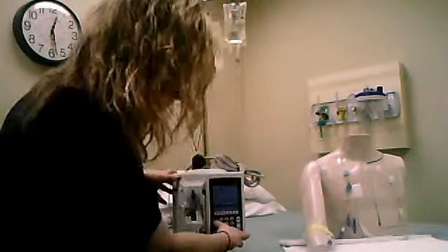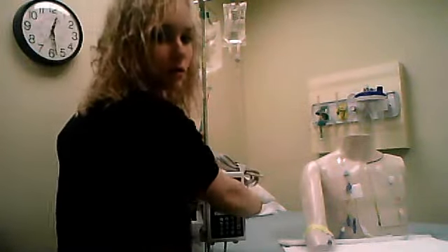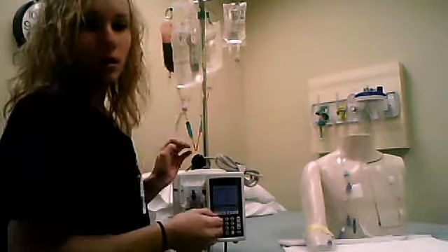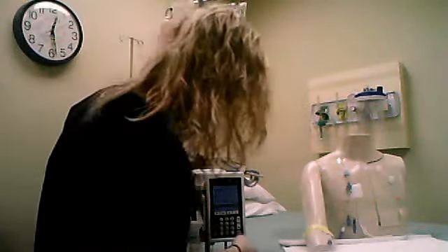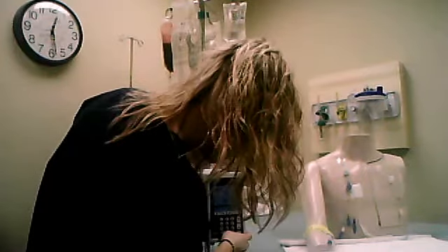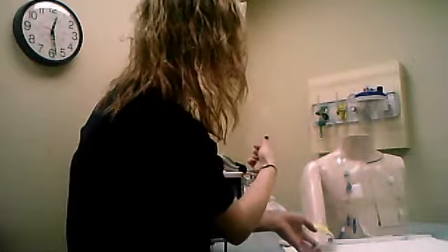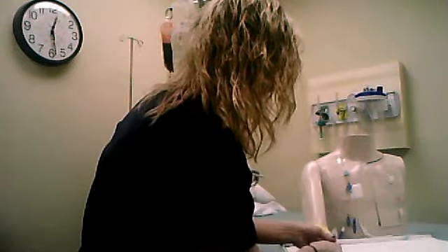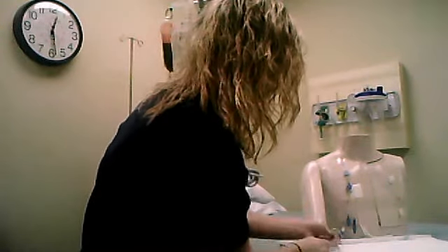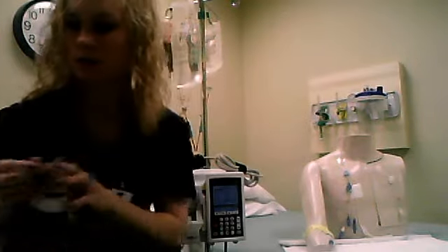So we can go ahead and start that. And also lock the safety on the back. And once the 10 minutes is up, we can disconnect that. Clamp it again. Discard of that.